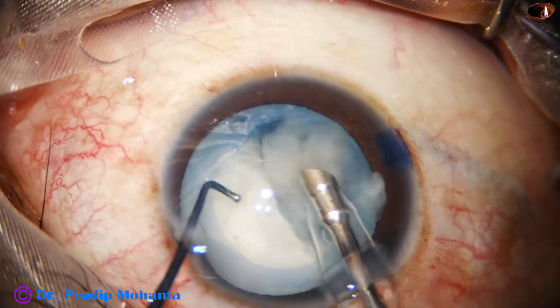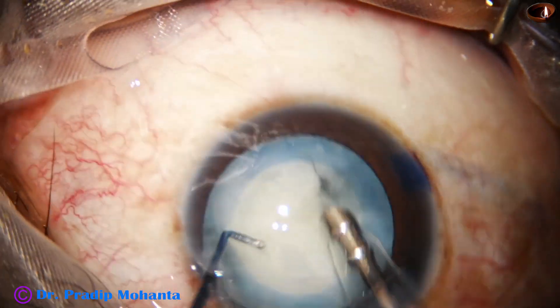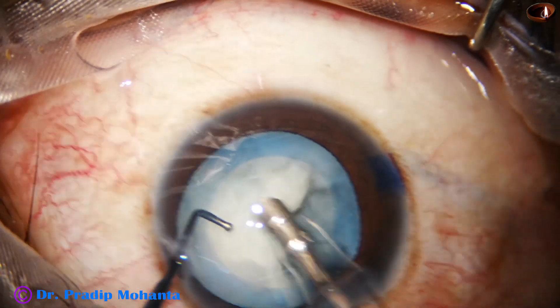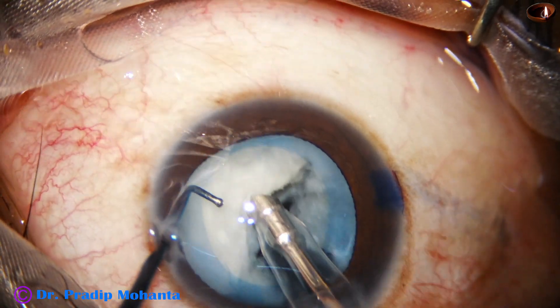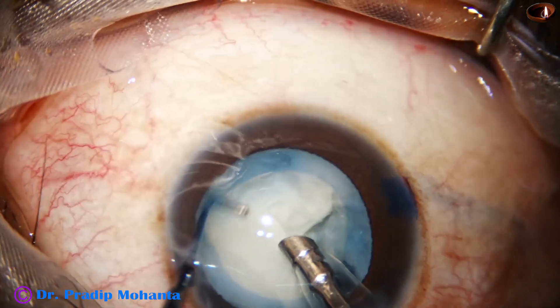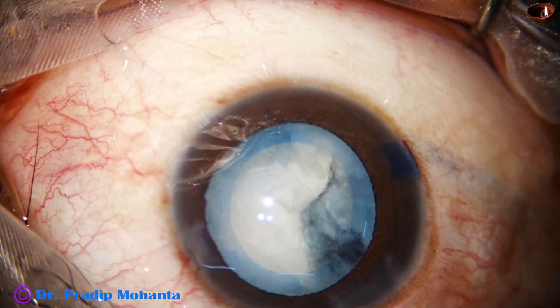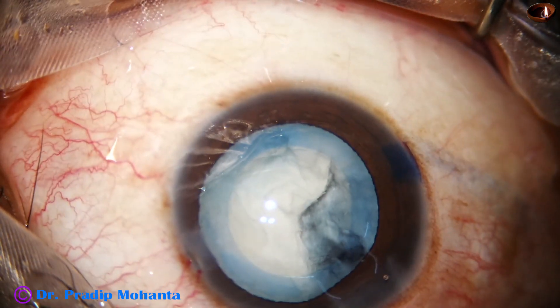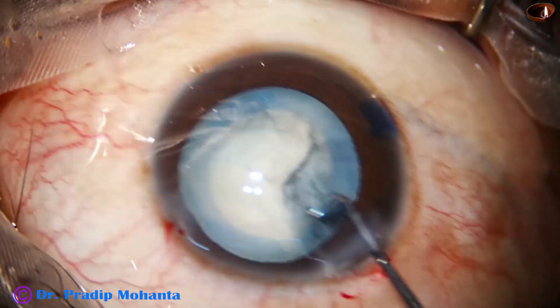I have done two hemi-nuclei and the hemi-nuclei are easily aspirated — they are waiting to be aspirated. I find that this hemi-nucleus is quite large, and if I try to hold it, it is just getting eaten up. It is dangerous to try to hold such soft nuclei, so I come out again and inject viscoelastic.